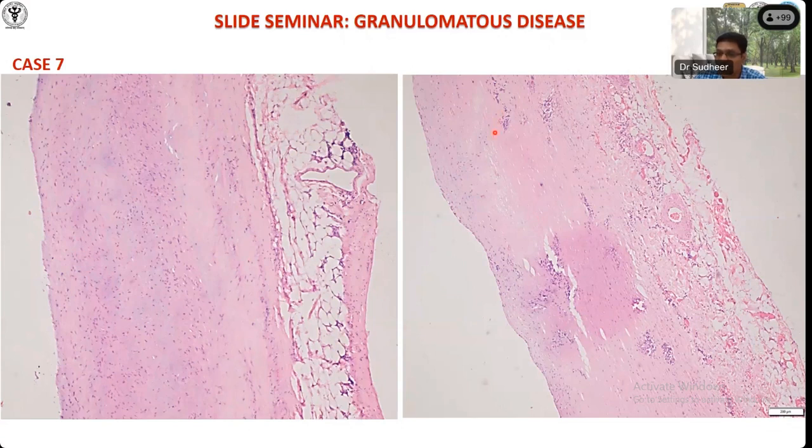Why has the wall become weak? If you see most patients, there is some patchy chronic inflammation, right? Can you see it here? Where, sir, is the inflammation located? Is it in the vessel wall or outside the vessel wall? The outer part of the media, sir. But the primary structure involved is the media? Media, yes, sir.